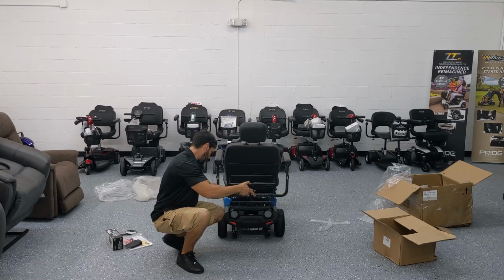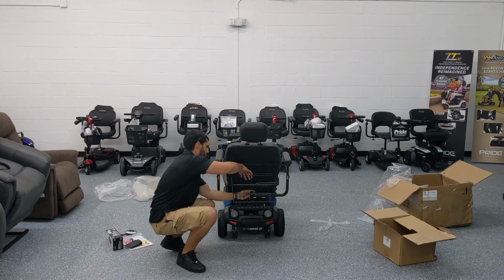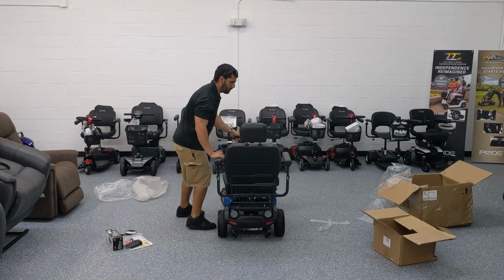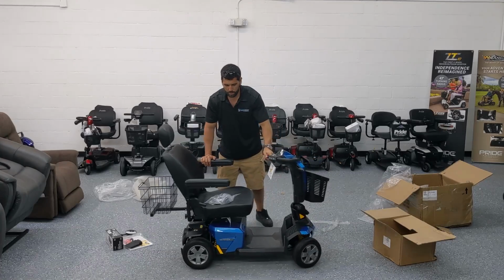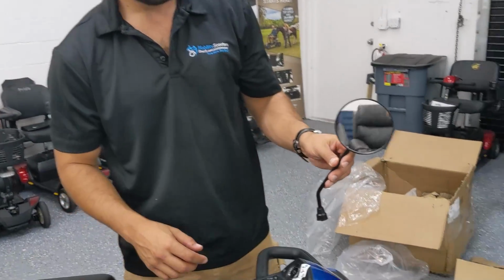Once it's in, and you can line up the holes, you can actually just put that pin in and then tighten the knob down so it doesn't wiggle. It's basically a backup for the pin and to keep it from wiggling. So the basket's in now, very easy to do. The scooter is fully assembled and ready to go.